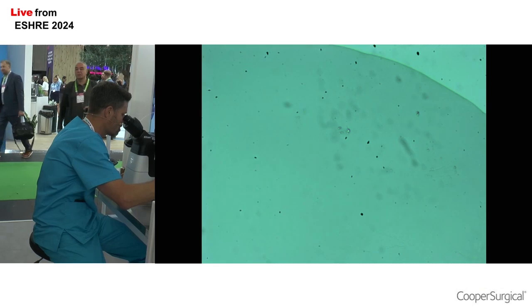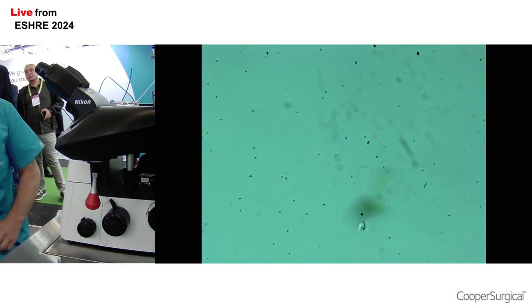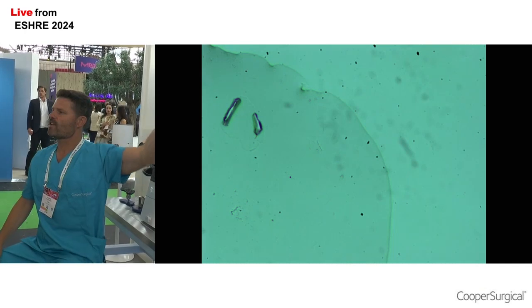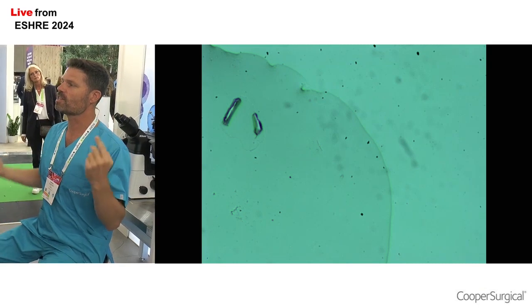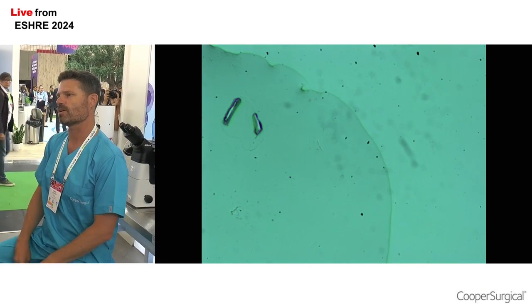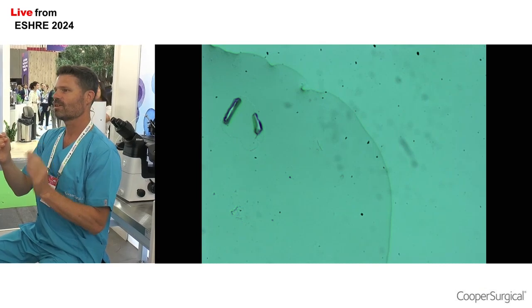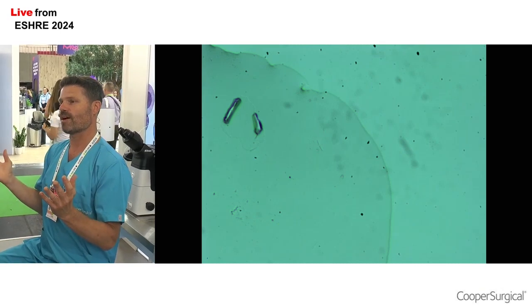If we go right over here, if I go right to the very right-hand side of the drop, in this sample we don't really have any sperm that have been able, so far, to penetrate through here. But if we did, we wouldn't select these sperm, because these are the sperm that have good motility, but they haven't reacted with the hyaluronic acid because they've been able to get through to this part of the drop. So this is a little bit different to a normal ICSI, because in a normal ICSI you might say, I want the good motility ones. Here you want the ones that have been stopped at that point. So we're going to select those ones. So this is a practical demonstration of how it works.